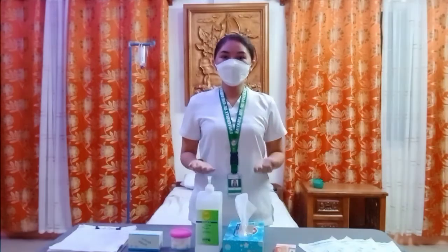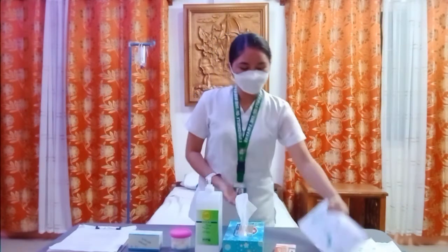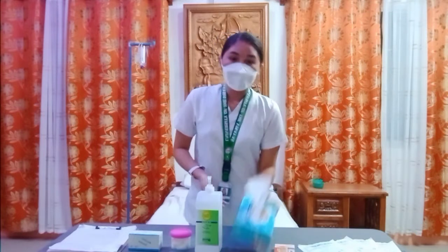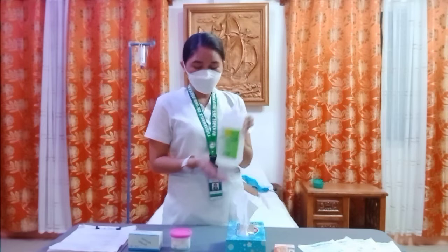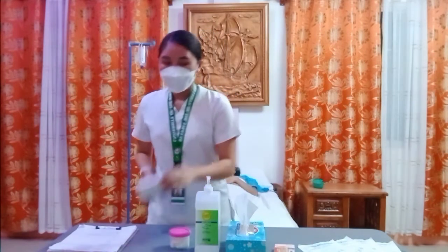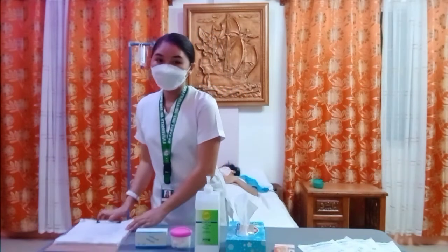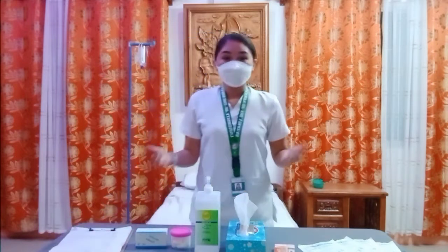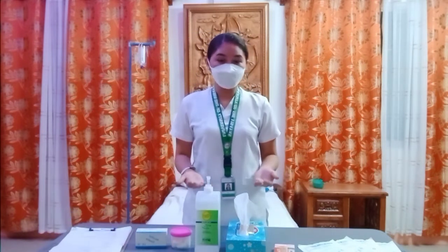First is to assemble equipments. Here we have a disposable glove, a digital thermometer, a box of tissues, an alcohol, cotton balls, and alcohol swabs if there are any. And of course, a patient chart. This is done to save time and effort and to carry out tasks in a systematic manner.